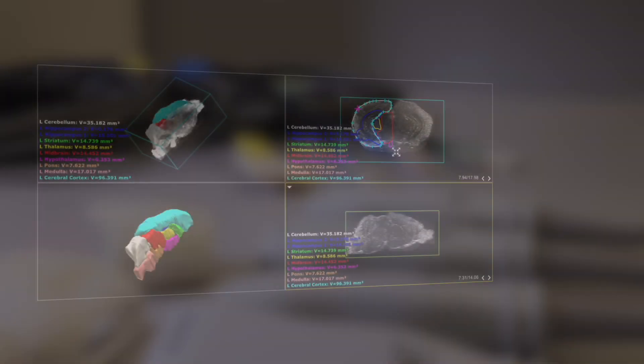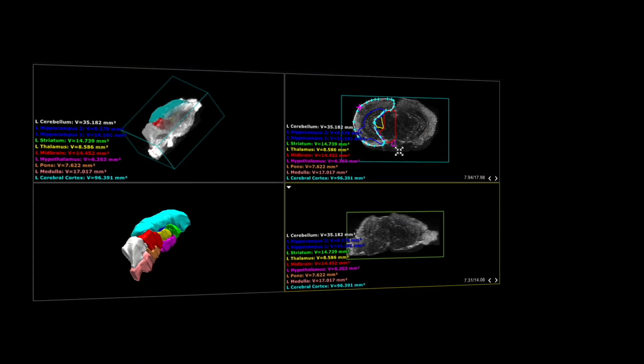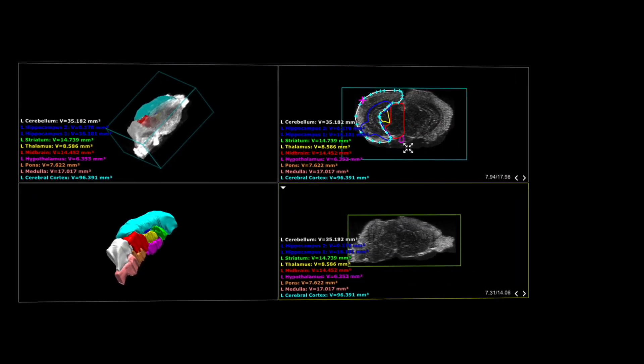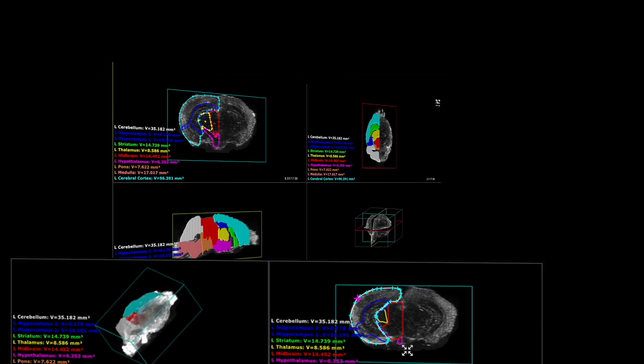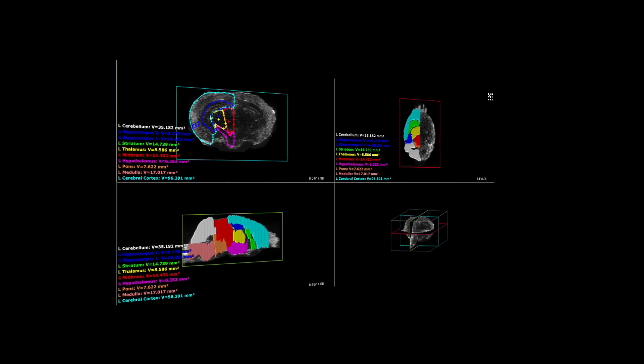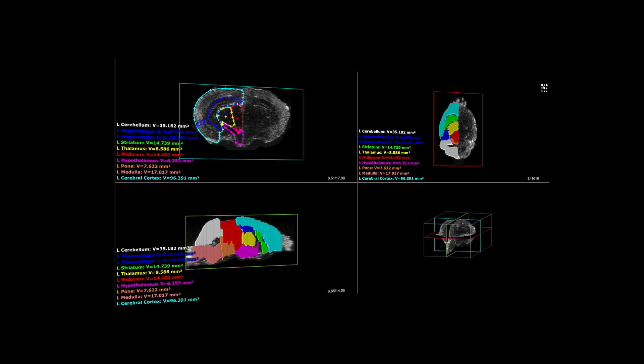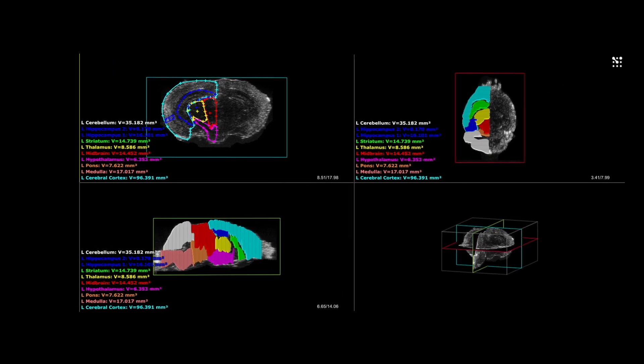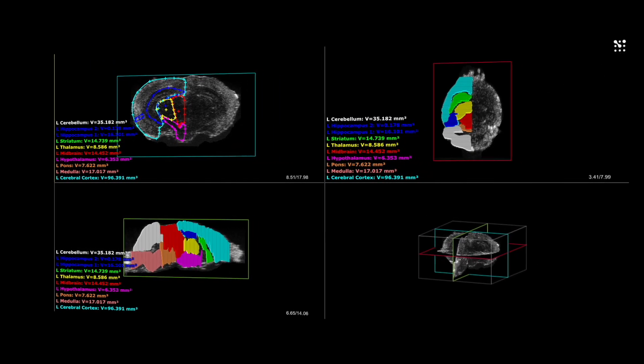For improved workflows, we have also incorporated a neuroanatomical reference into our Vivo Lab software. This brain atlas ensures that you know which area of the brain is generating the signal.